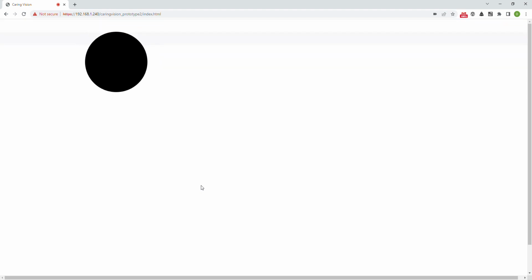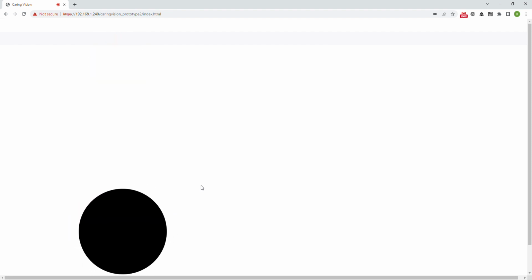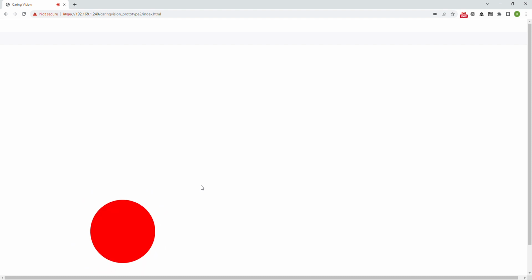So the calibration process is continuing. The calibration process will take varying amounts of time. If I'm a very good candidate, which by the way I'm not, because I'm looking away from the screen and I'm misbehaving a little bit, then it can be done within about a minute. In my case, probably another 30 seconds or so, I would guess.